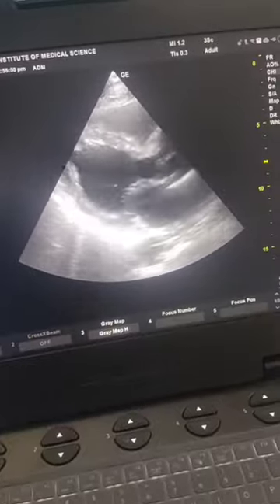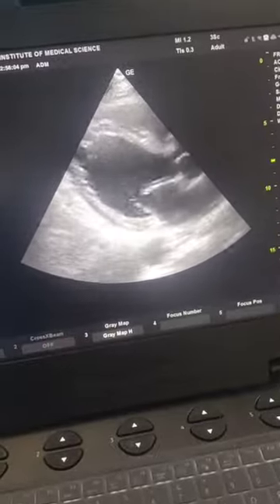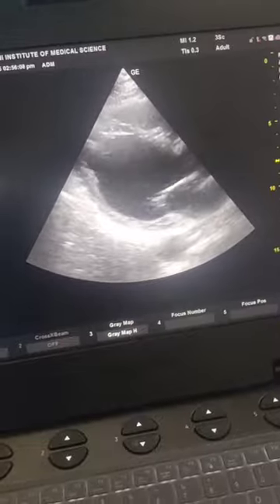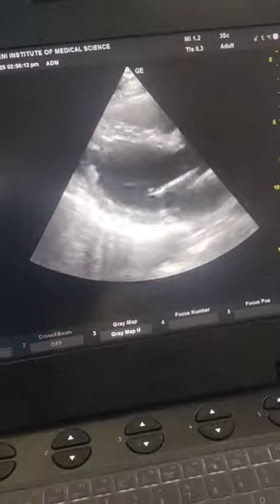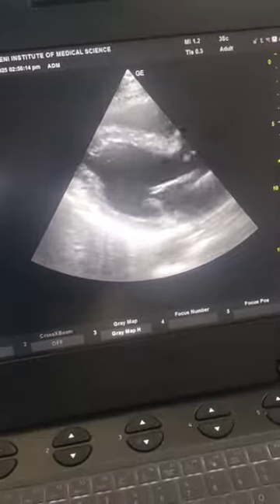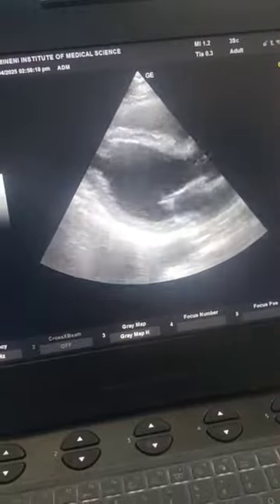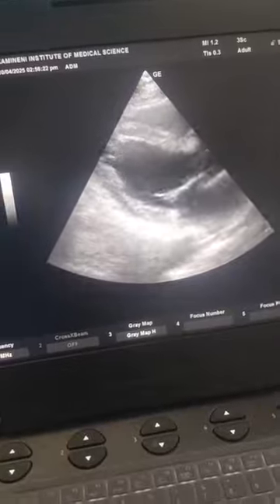And of course he's got left ventricular hypertrophy, he's got a dilated aortic root and a fairly well dilated left atrium, all suggestive of a left ventricular end diastolic pressure rise, and essentially most likely a coronary artery disease, because we can see that the interventricular septum is also not moving properly in comparison with the posterior wall.